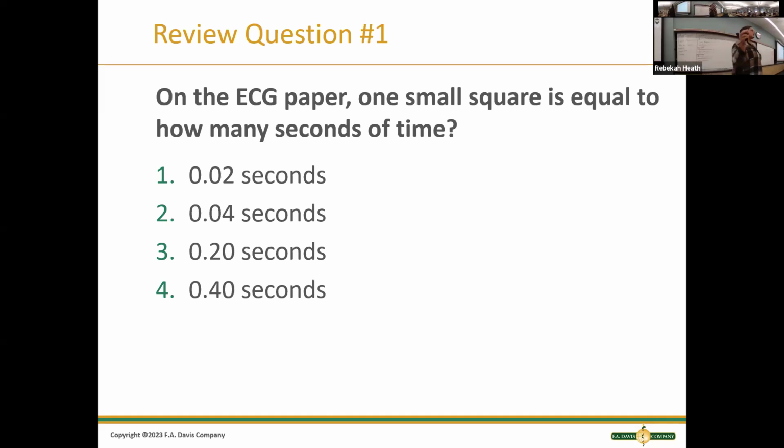That's what we're looking for. Anytime we have an EKG tracing, we want to see where it's flat, because that lets us know where baseline is. And just like with my drawing, it's not always exactly flat or straight. It might change and move just a little bit.